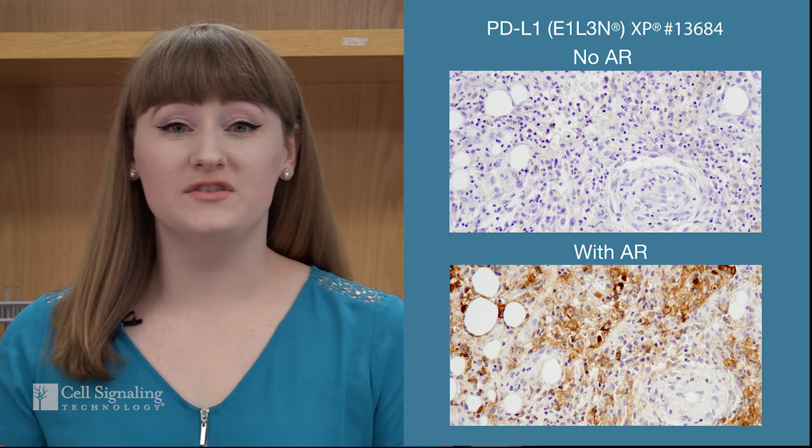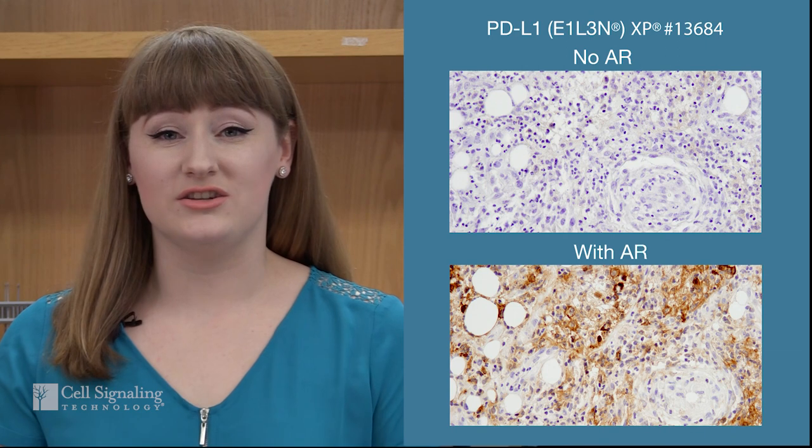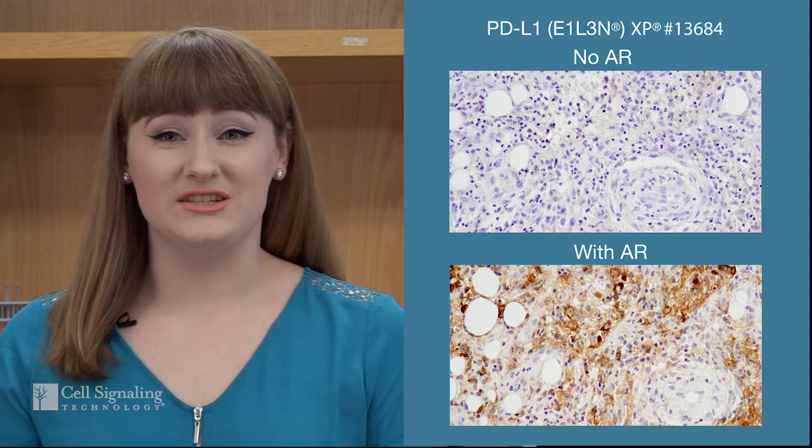Antigen retrieval, also known as AR, is one of the factors that can influence the strength of staining obtained in IHC. AR may be accomplished by treating the sample with either heat or enzymes. In this video, we'll focus on heat-induced epitope retrieval, or HIER for short. Antigen retrieval takes place after deparaffinization of the sample and before the addition of antibodies to detect the target proteins. AR removes the crosslinks formed as a result of aldehyde-based fixation and unwinds a protein's secondary and tertiary structure, making epitopes accessible to detection by antibodies. This can be particularly important for epitopes buried deep in the protein structure.